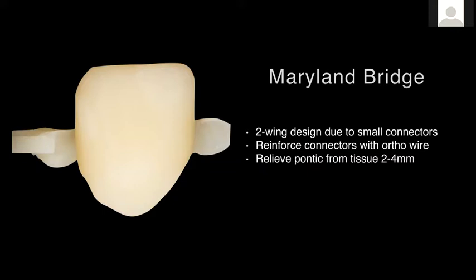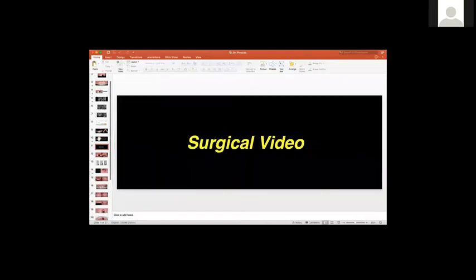That should be adequate. All right, so then at this stage, I will just switch over and show you the surgical video of this case. Here, I just have to bring that up here. And let me go ahead and go to the full screen mode if I can.